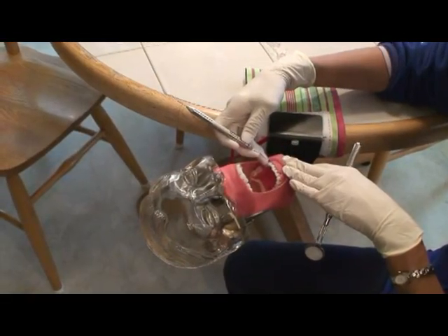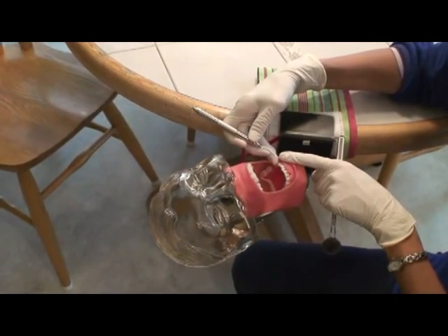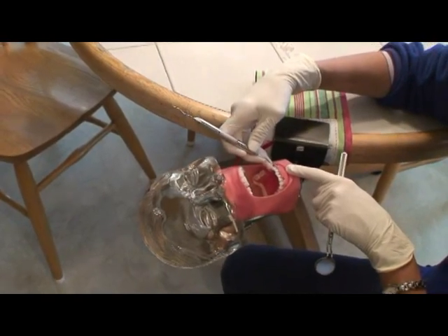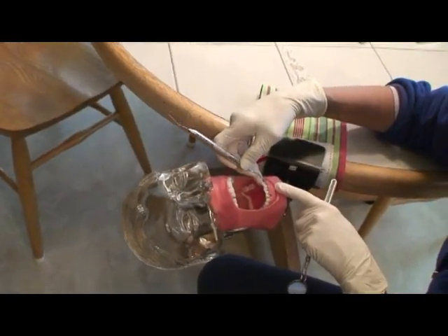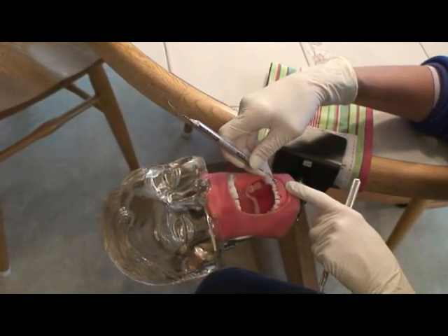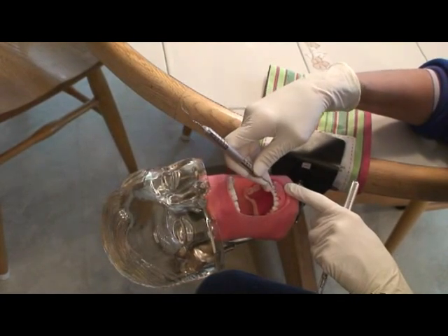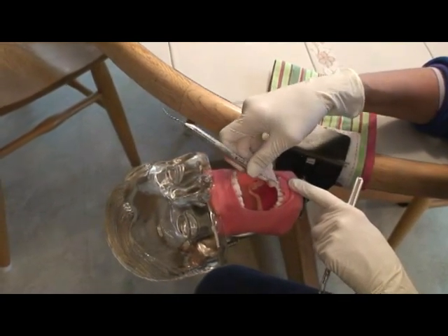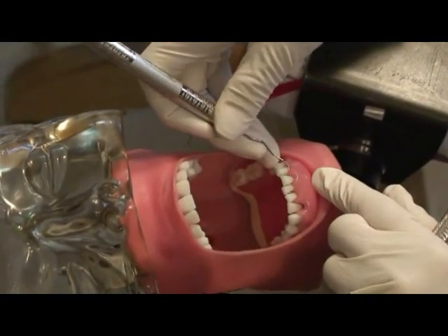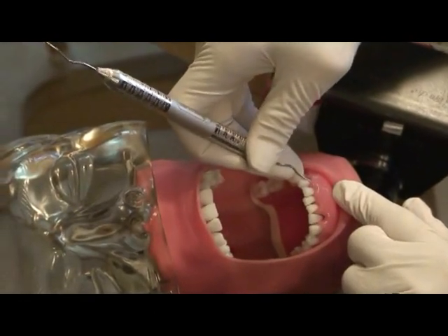For the 11-12 explorer, the technique is the same. The shank and the working end are just a little bit smaller. So we'll start at the middle of the tooth, splitting surfaces, and work towards you. All right, 11-12 explorer. The technique stays the same.